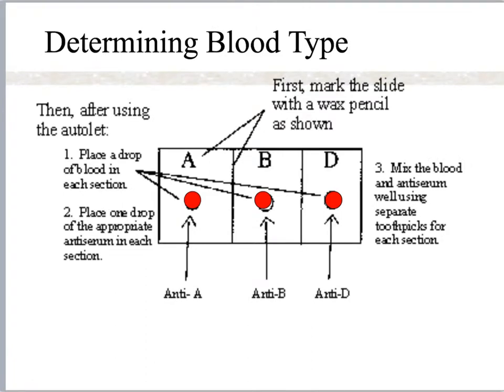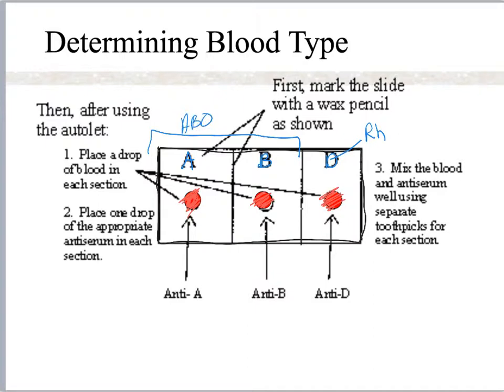When it comes to blood typing, you are drawing blood, and here I am demonstrating a slide where we have put three little drops of blood on it — right here, right here, and right here. We've labeled them A, B, and D. D goes with RH, and A and B go with the ABO blood type.